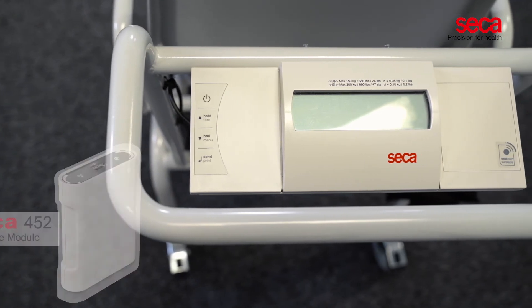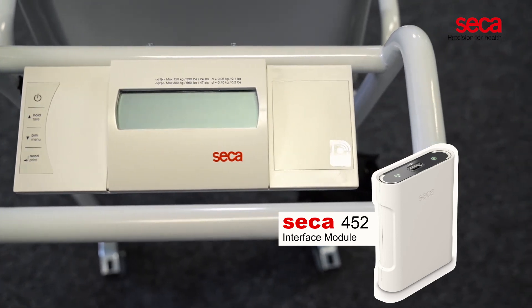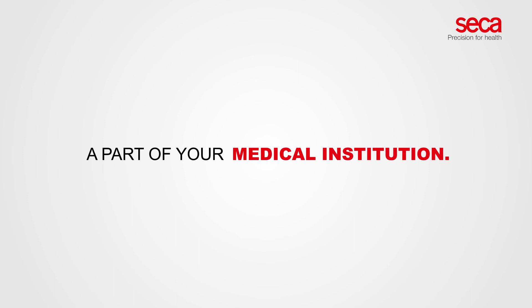To avoid manual transcription errors, the Sika 954 can be equipped with the optional Sika 452 interface module that allows for direct data transfers to any electronic medical record system. We just love the Sika 954. Ask us how to make the Sika 954 a part of your medical institution.